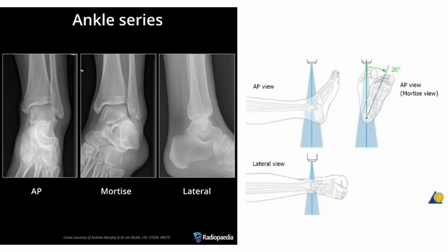So we go to the ankle. Usually the orthopedic people, also the people from surgery, order an ankle series.